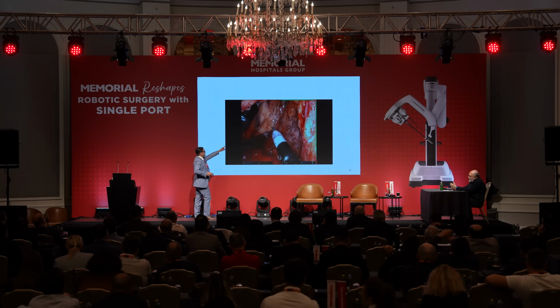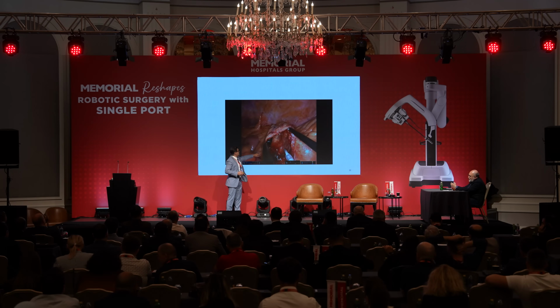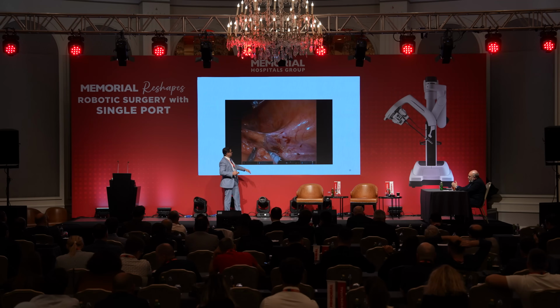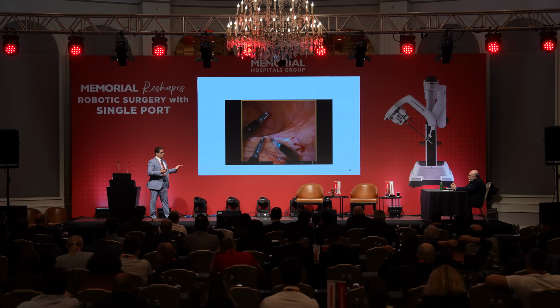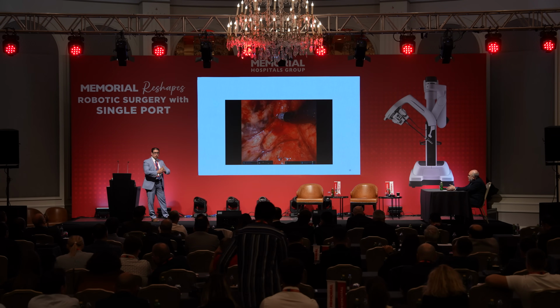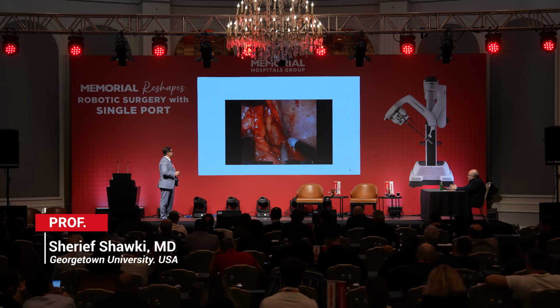The IMV is up. This is the duodenum here, ligament of Treitz. The pancreas is here. And now I go lateral to medial. I did not try to do medial to lateral with the SP yet, but I can do it laparoscopic or multi-port robotic. But I see benefits in doing lateral to medial for ease of mobilization and ease of using the small arms with the small spans.